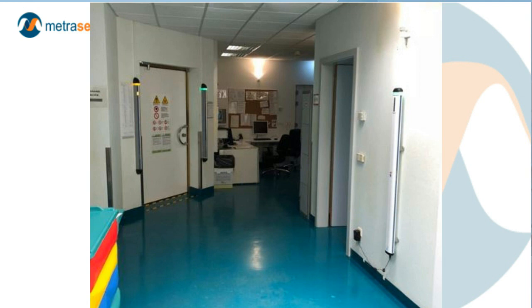Plus, you really want the opportunity to visualize the alerts, the information from these detection systems before you're at or going through the door. So both the ACR and I personally don't put them inside the magnet room, put them on the outside, more similar to what you see pictured here.